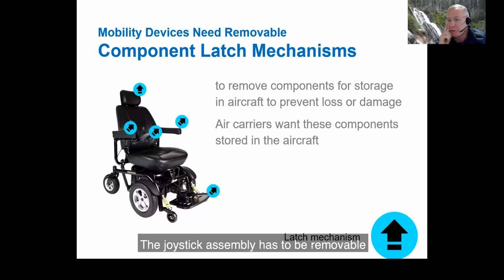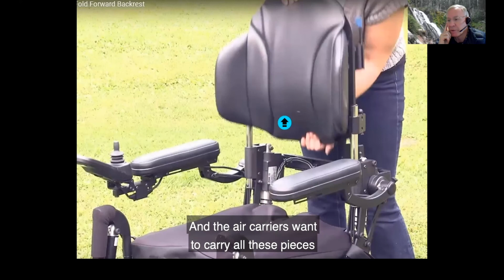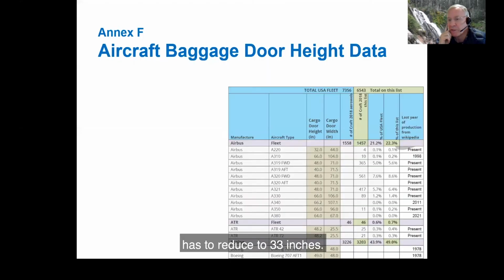The components of the chair have to be removable. The joystick assembly has to be removable so that it is not damaged. And the air carriers want to carry all these pieces on board the aircraft. The back support comes off on this chair. And then the height of the mobility device has to reduce to 33 inches.